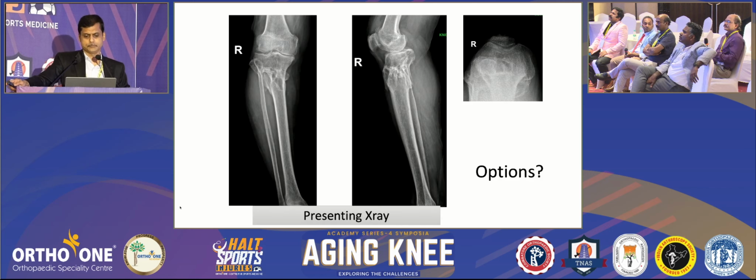This patient has a recurvatum deformity, or upslope on the tibia, in the sagittal view. So in case you are doing a CR knee, if the PCL is intact, don't give it too much slope because it is going to cut too much. So your slope, even for a CR knee in this case, should be 3-4 degrees. Will you use a robot or kinematic? Kinematic can be done because the knee is not subluxed and the deformity is well within 10 degrees. And robotic will give us a very good assessment of the slope of the tibia and help recreate that slope.